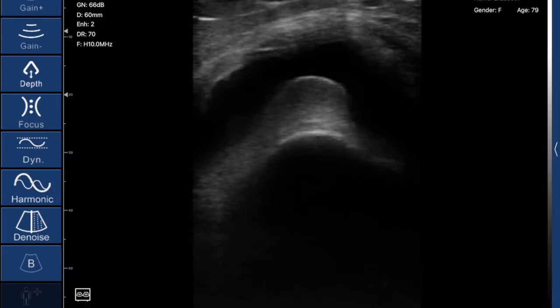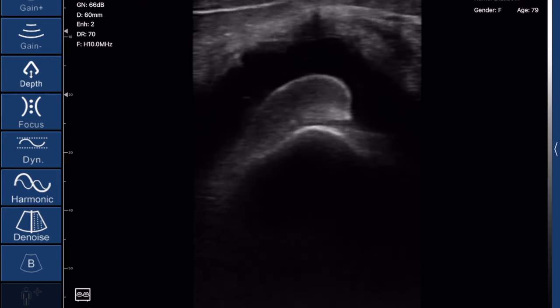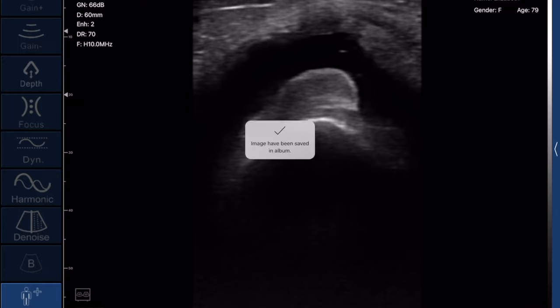The last scan I'm going to show is a patient who was complaining of knee pain. You can see here there is a severe amount of fluid around the kneecap, meaning there's a knee effusion that needs to be addressed. Those were a ton of the scans I've done with this probe, and I absolutely love it.